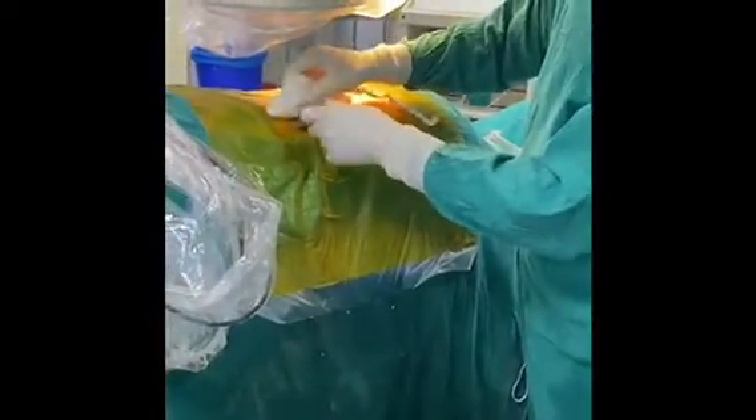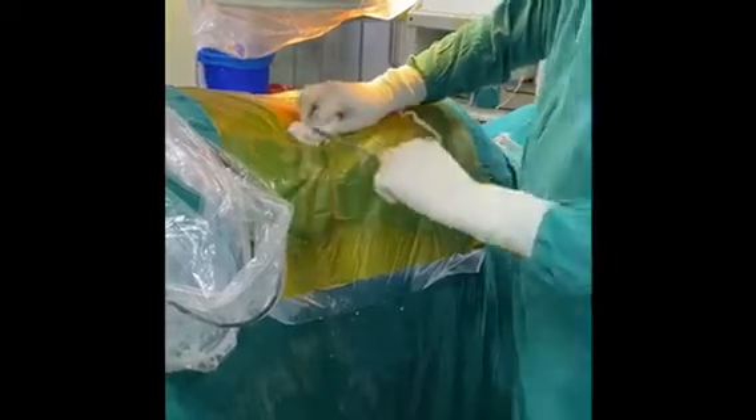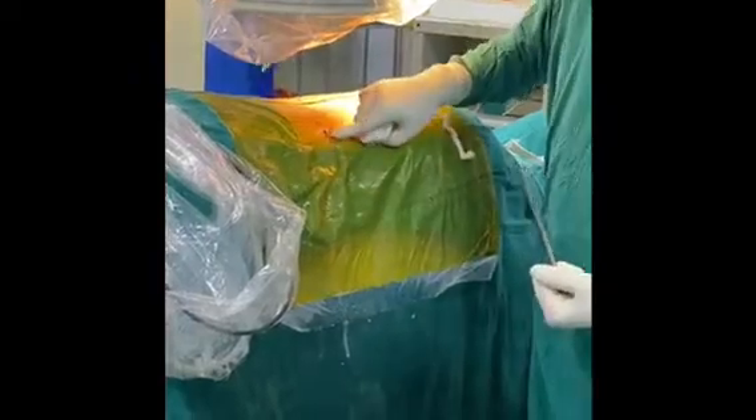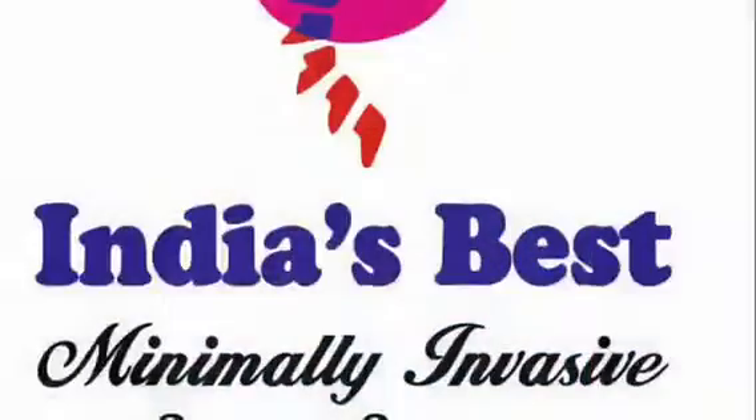The disc has now been removed and the procedure is over. When we remove the working cannula, the only thing left on the body is just a small hole, requiring just one stitch.